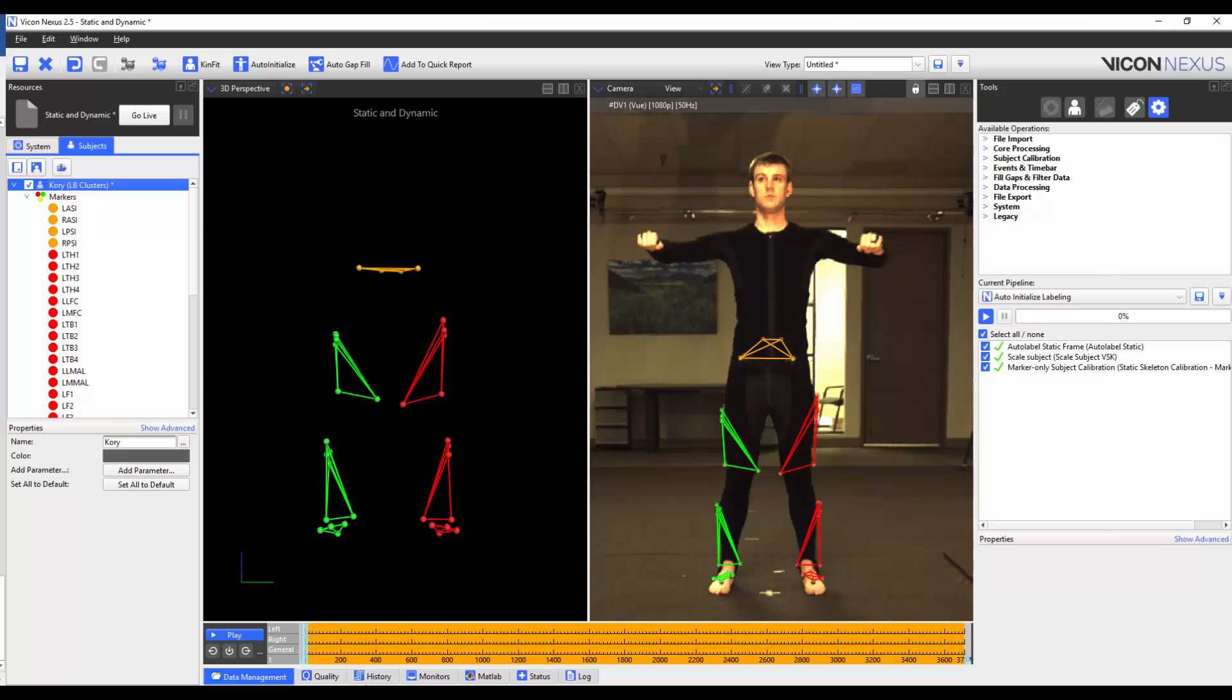In the next part of this video, I'm going to show you how to change the marker properties. Nexus 2 is very flexible for these operations and so while I present these operations in a specific order, these changes can be done in parallel. With that said, you may want to rename markers before scrubbing through your ROM trial to make checking and relabelling markers easier. Please remember to create your segments and link them on the same frame.